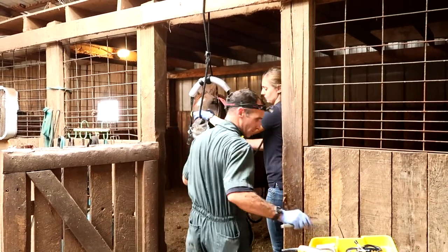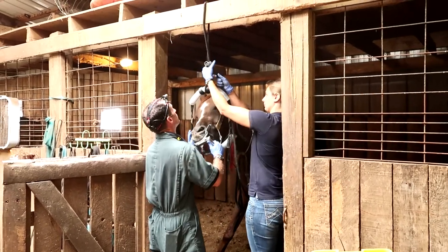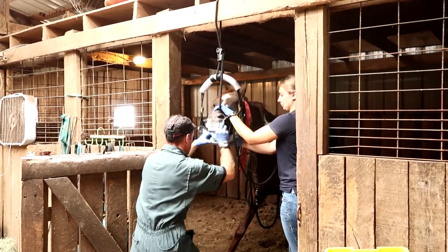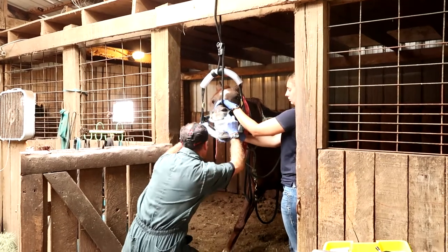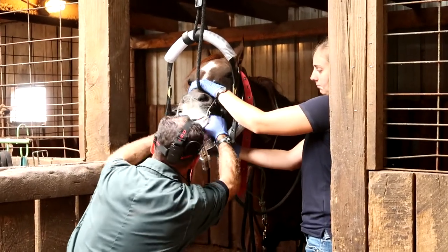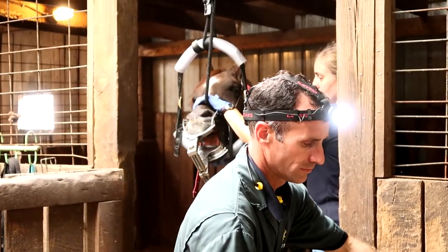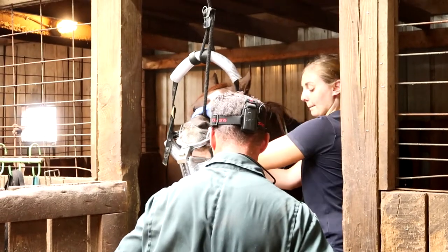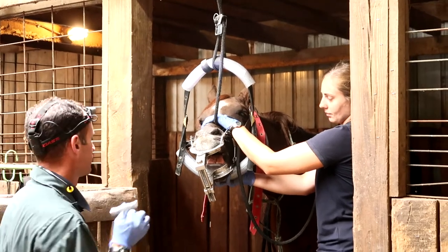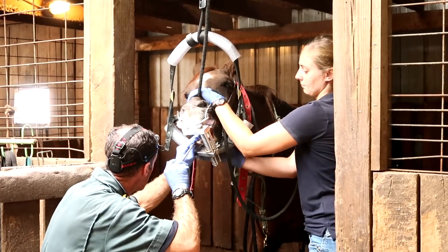When horses eat, they move their teeth up and down as well as side to side so that they completely grind down whatever food they're eating. If their molars don't meet perfectly, with all this continual grinding, they'll start to develop sharp points on the outsides and insides of their teeth. Once these sharp points start to form, it can cause ulcers or sores in their mouth so that when you're riding, they're less likely to want to pay attention to what you're asking because their mouth hurts. Dr. Scott is sticking his fingers in to feel along Tino's mouth on the top and bottom, just to see where the sharp points are and where he's going to have to work.